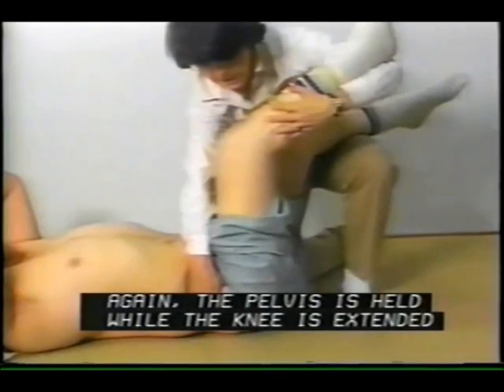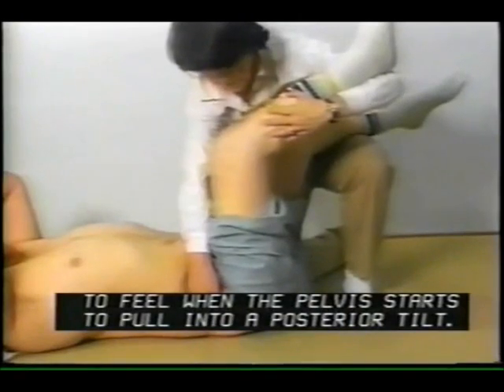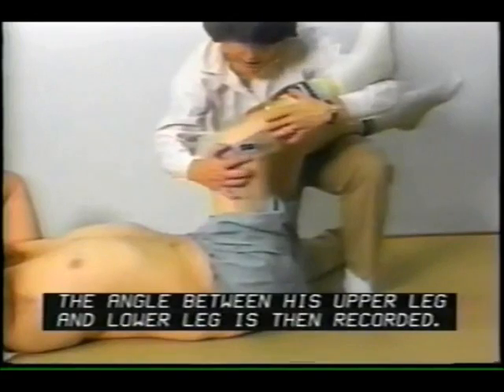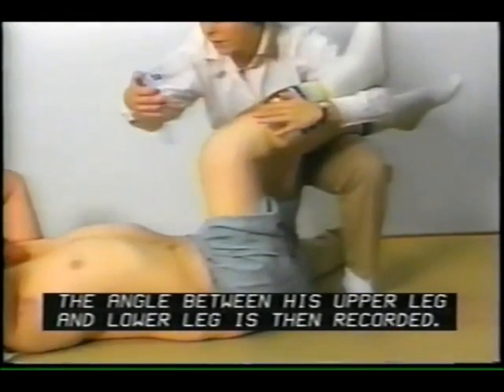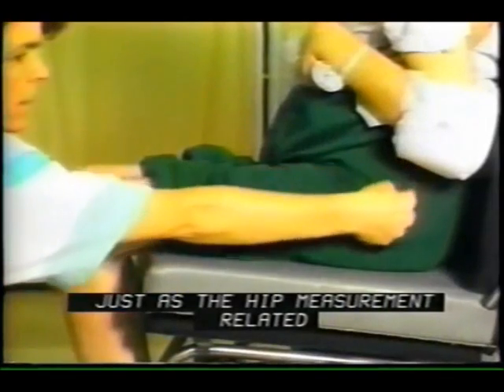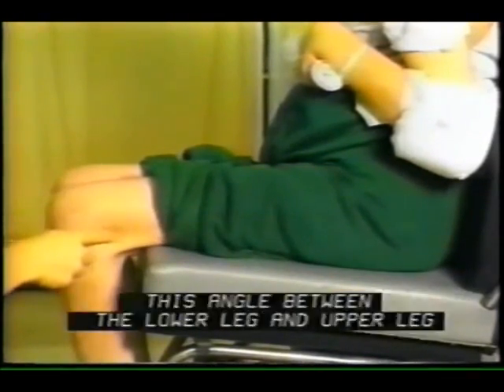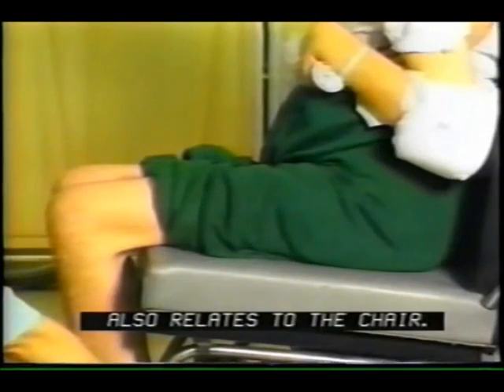Again, the pelvis is held while the knee is extended to feel when the pelvis starts to pull into a posterior tilt. The angle between his upper leg and lower leg is then recorded. Just as the hip measurement related to the seat to backrest angle of the chair, this angle between the lower leg and upper leg also relates to the chair.